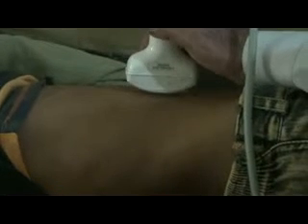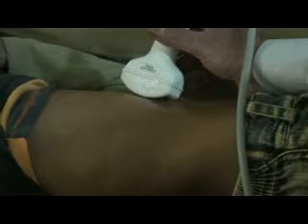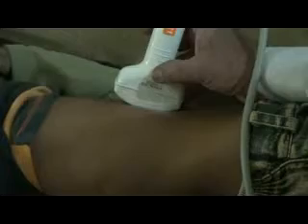Now again, our young patient. Why I'm doing it in different positions and different angles to visualize the gallbladder is that you will see a lot of anatomical variation regarding the gallbladder placement. It is different in every patient, in every person. So that's why you may have to adopt a different approach in different patients.